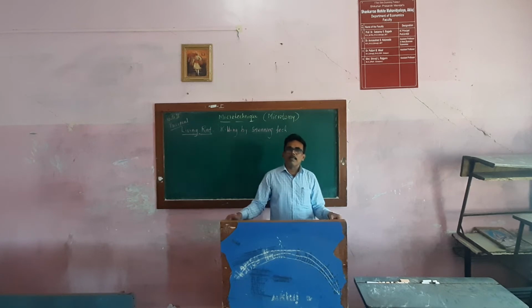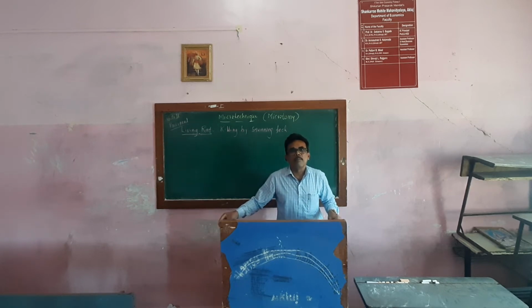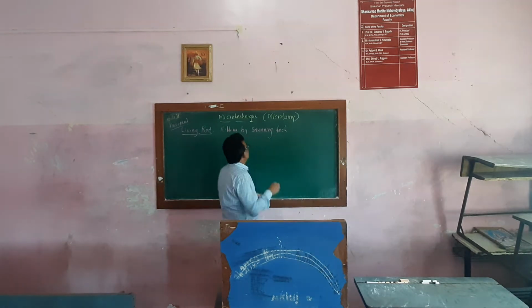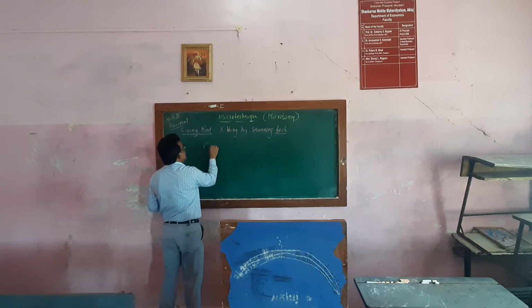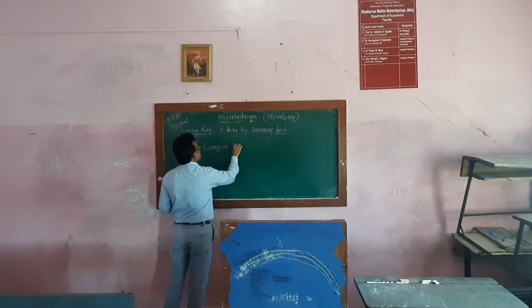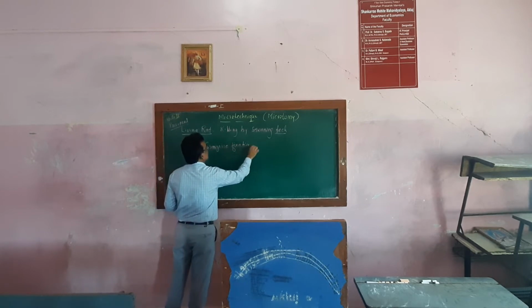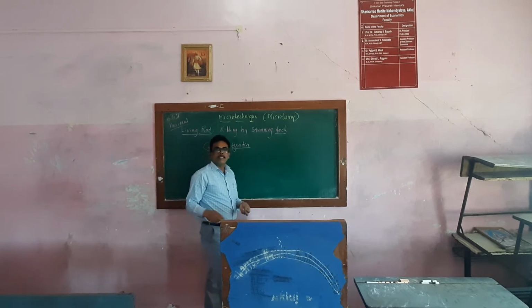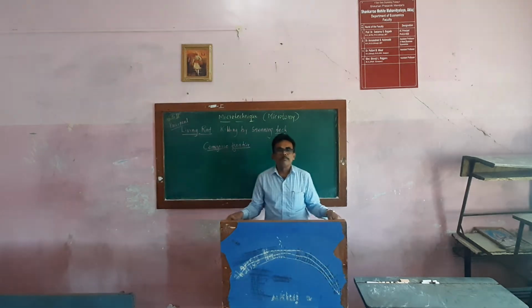All these organs of that animal are dissected out and put into a particular fixative, called Carnoy's fixative, or you can say the formalin fixative.